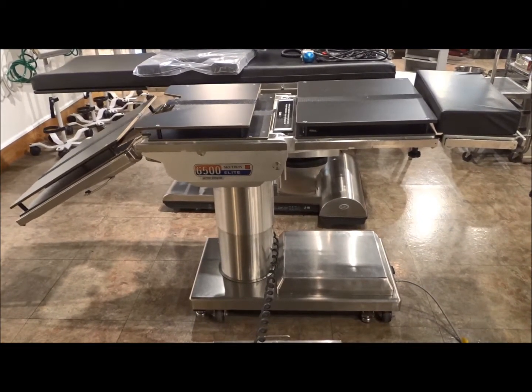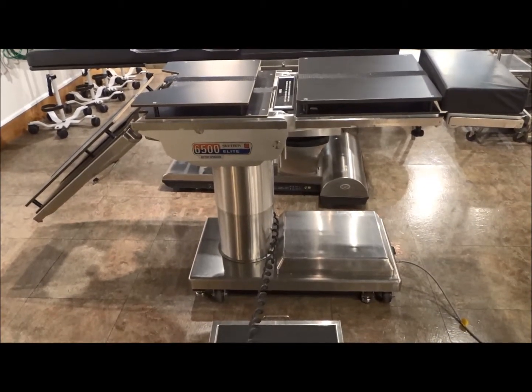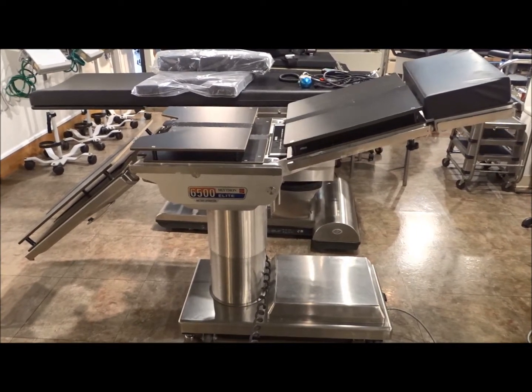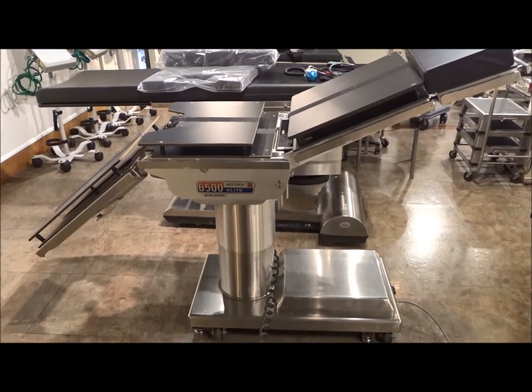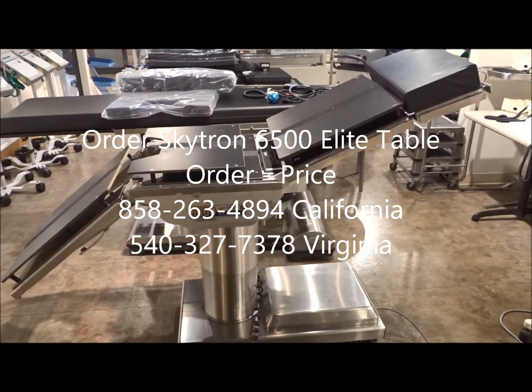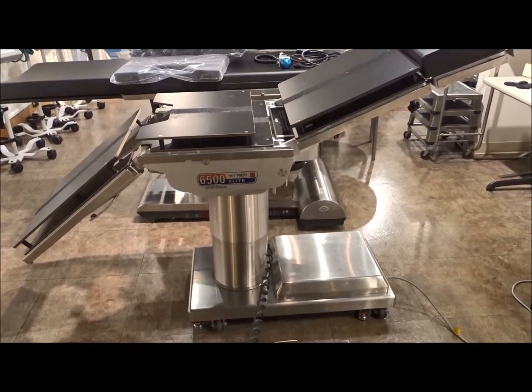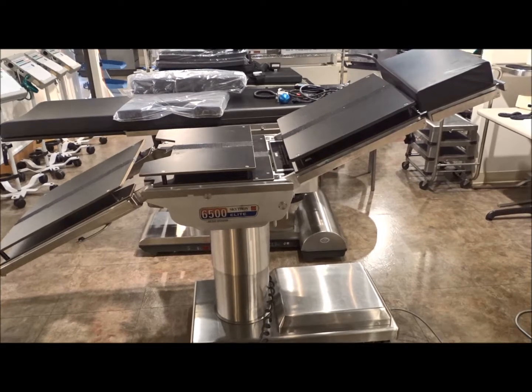They can also come with arm boards, depending on the types of procedures that are going to be done. As you can see, this table has a lot of functionality and range of motion for various types of procedures. So if you're looking for OR tables, surgery tables, or actually all types of surgical equipment, we can help.